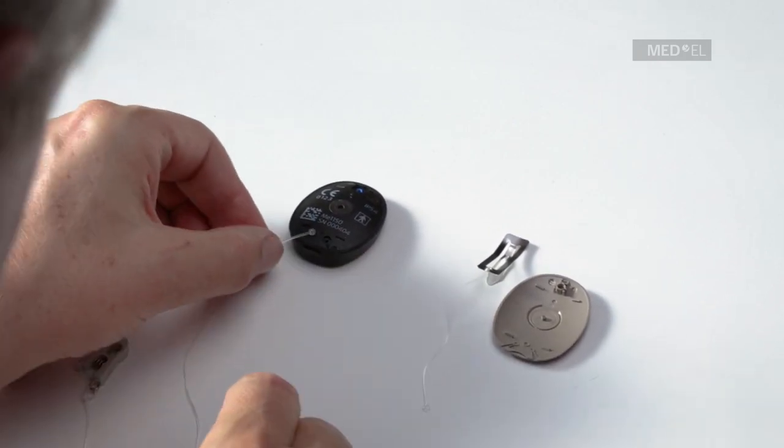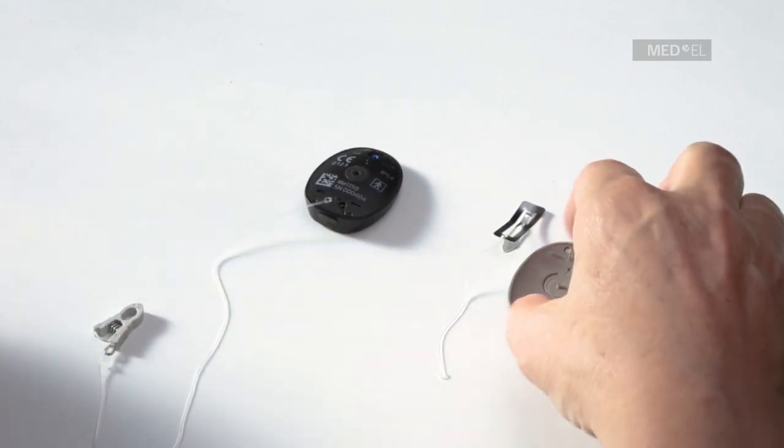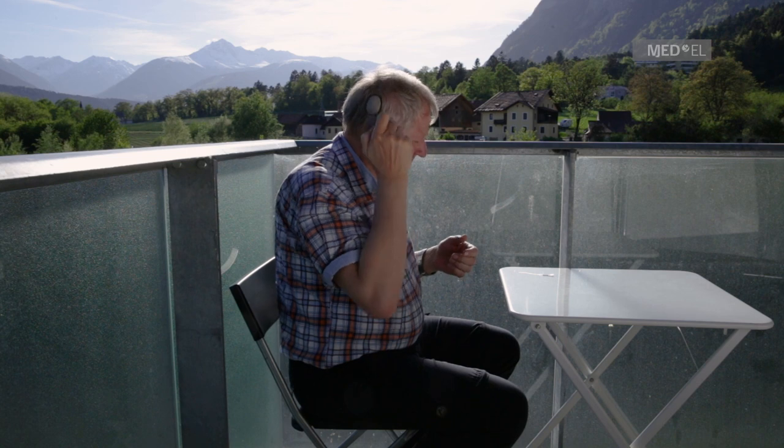Remove the cover from the audio processor. Push the circular end of the leash into the matching groove at the bottom of the processor. Replace the cover, securing the leash in place. Clip to your hair or clothes.